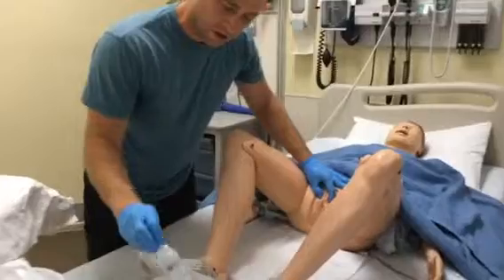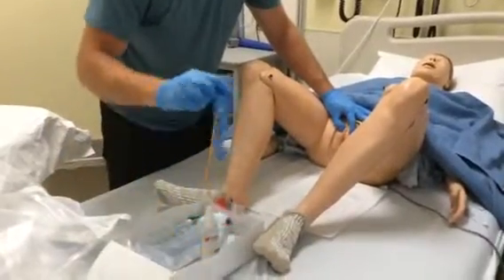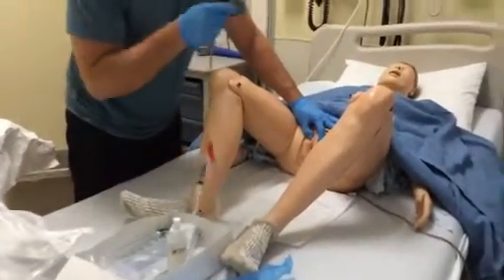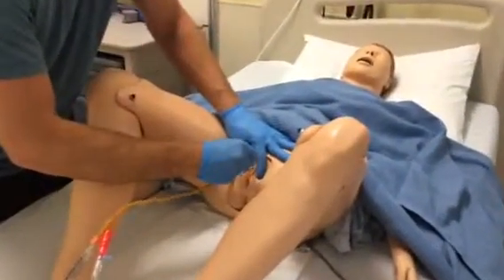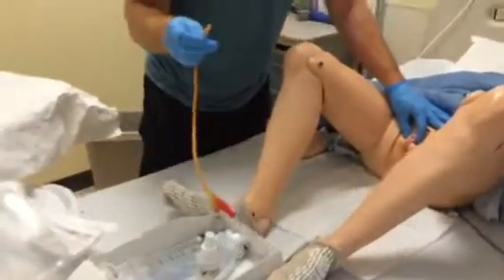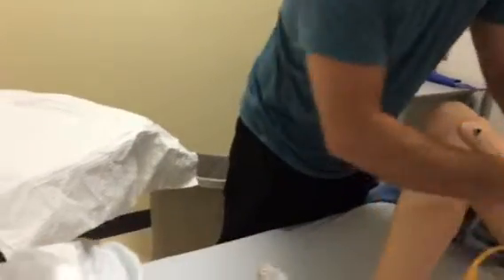Obviously that wasn't ideal just there, but just to get a little bit of lubrication, and I would spray this with lubrication, and I'm going to go ahead and insert this now. And I think I will need a little bit of that lubrication if my assistant doesn't mind giving me a little spray here. Sure will. Okay, thank you.